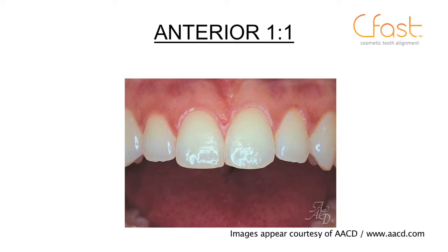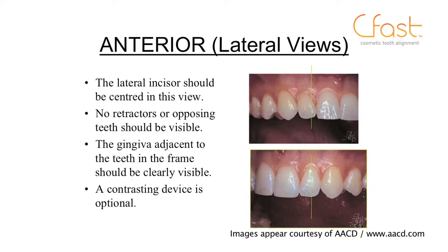And that's another example of a one-to-one view. And then obviously, as with the previous examples, we're going to take that left and right. So the left view, which again is centering on the lateral incisor.